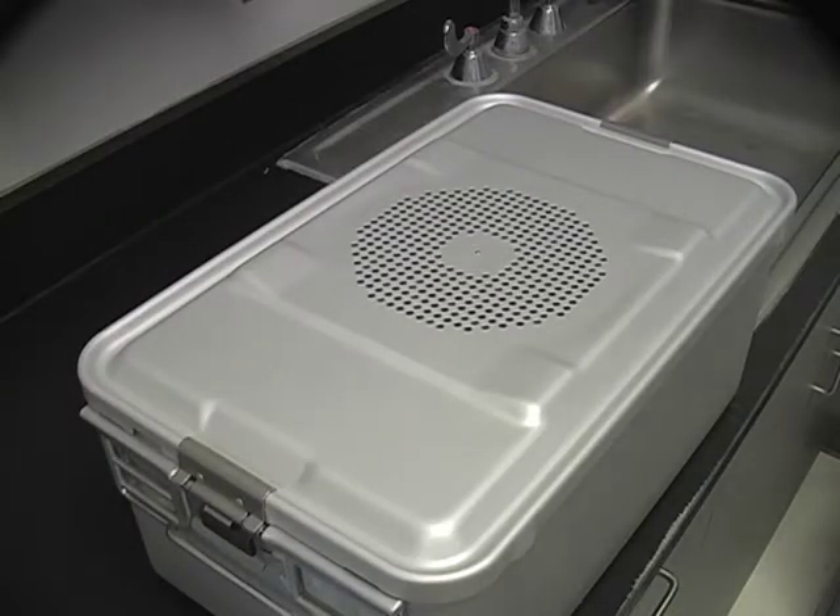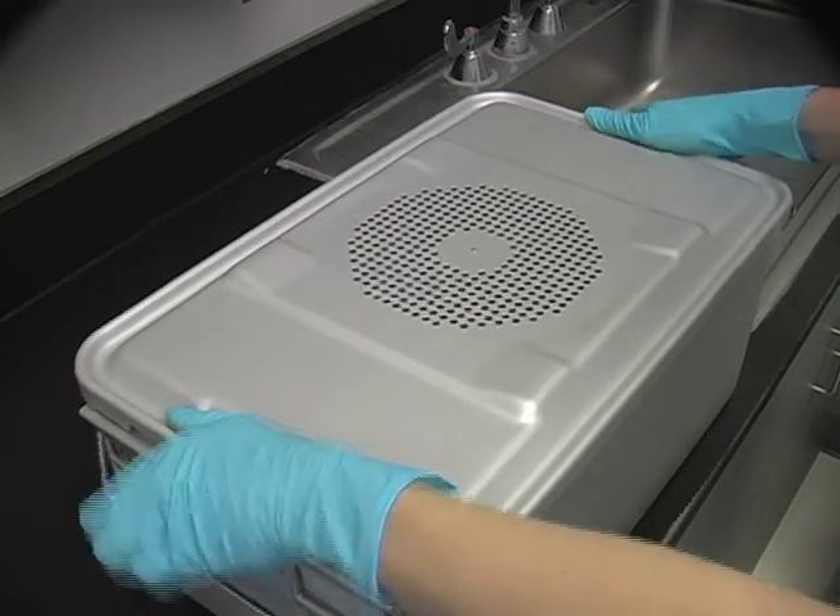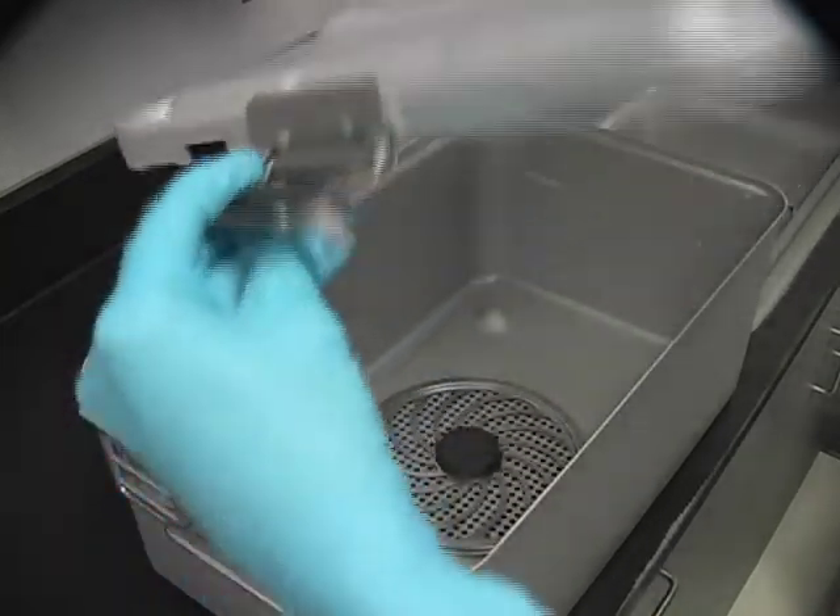First, remove the lid of the sterilization container by pulling the latches away from the container and lifting upward.